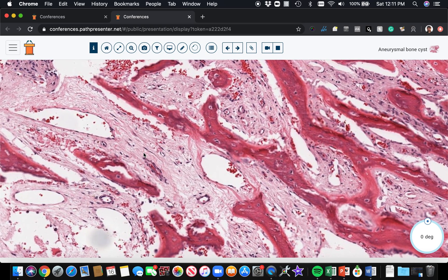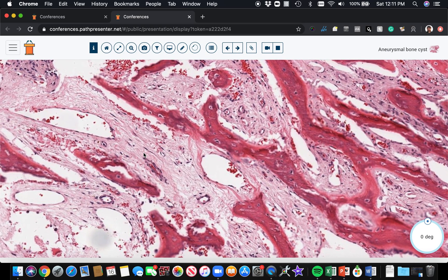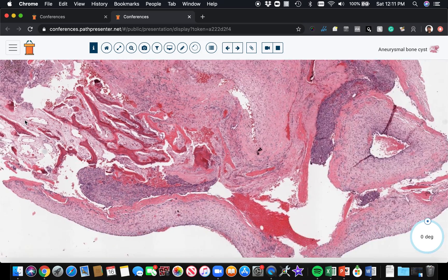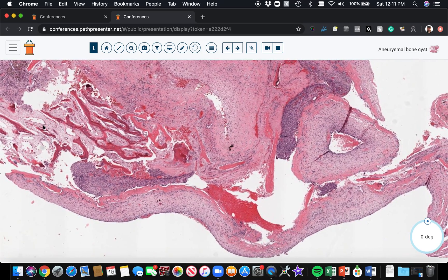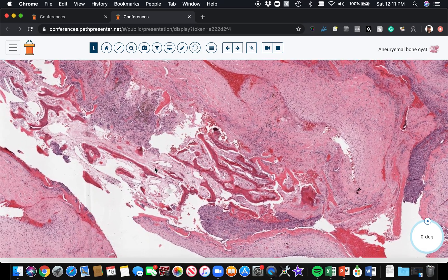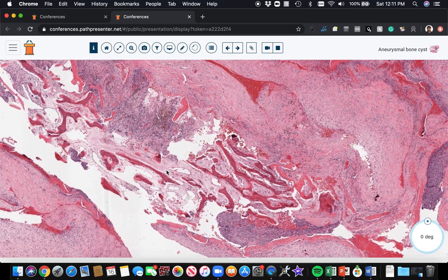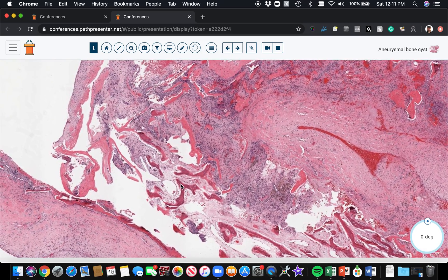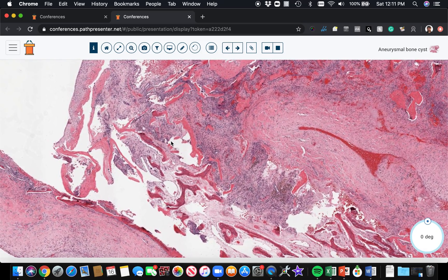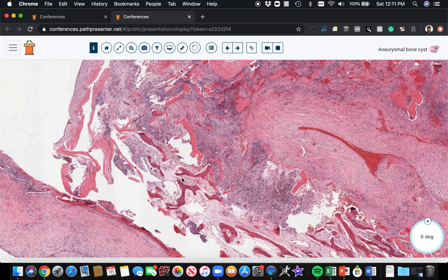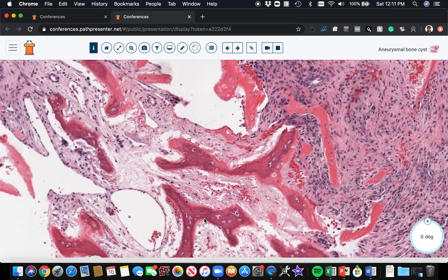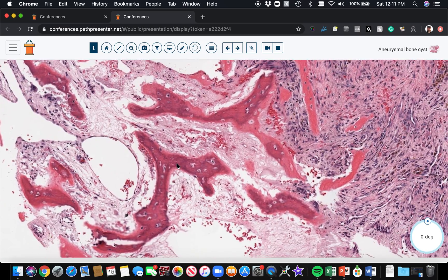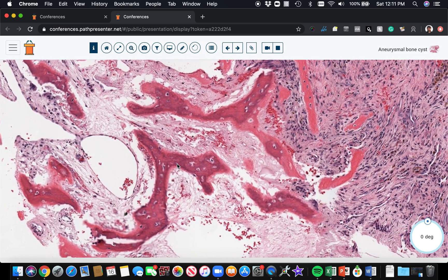And you can tell - well let's see, this one's not as in focus - but woven bone is little thin collagen strands all mishmashed together, and it doesn't have the nice concentric lamellar rings that you see in lamellar bone.